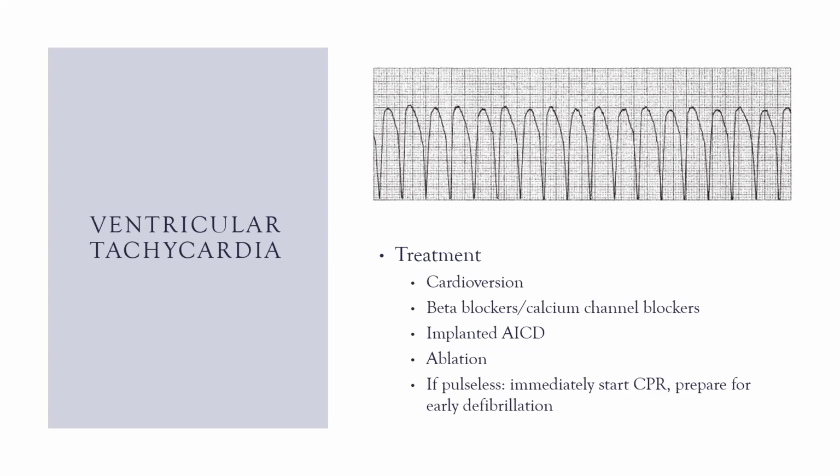Now, if you present to your patient and they are obviously not perfusing, i.e., they don't have a pulse, they're not talking to you, they are very unstable, we need to immediately start CPR, call for the crash cart, and as soon as the defib machine gets there, we need to defib this, okay? This is abnormal electricity, so this can be fixed with normal electricity. So shocking immediately, or early defibrillation is an absolute must in this situation. Again, if your patient's pulseless, not perfusing, not mentating, we go straight to defib.